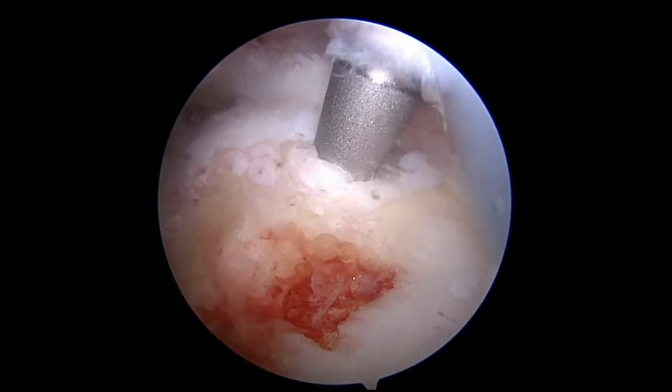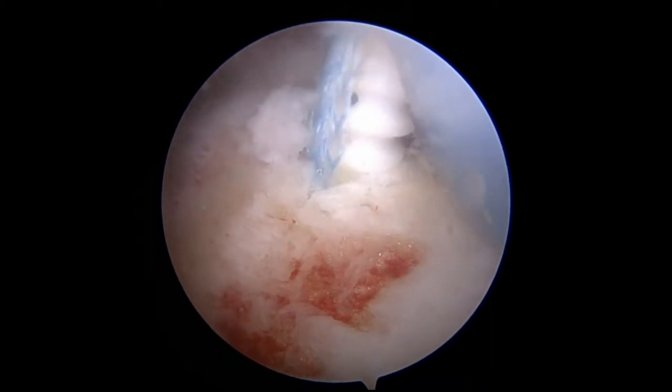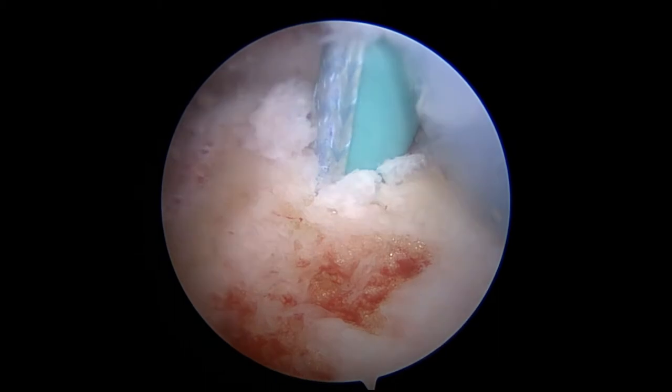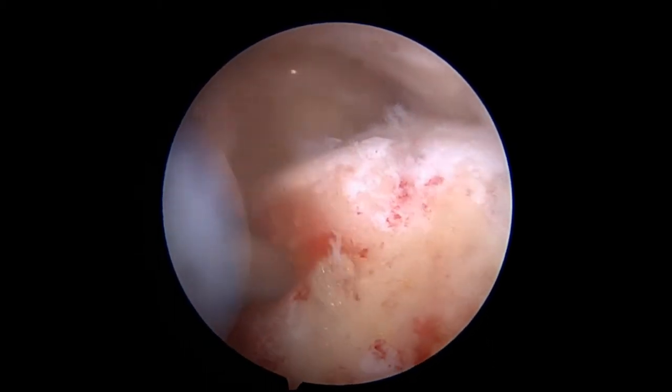Through a superior lateral portal, two 4.75 millimeter biocomposite vented swivel lock anchors with attached swedge fiber tapes are placed into the medial row at the greater tuberosity — one anterior and the second posterior.